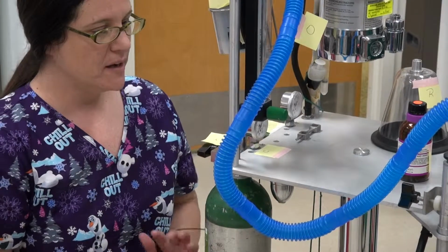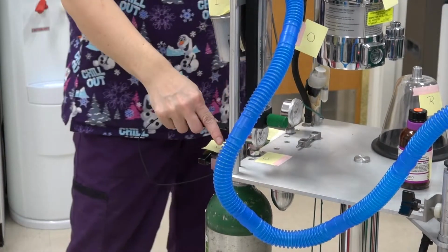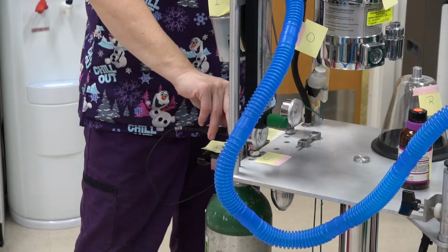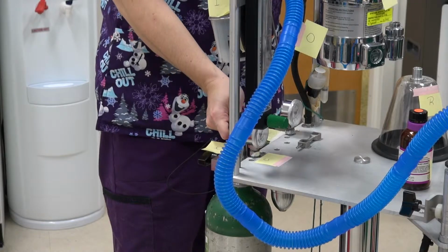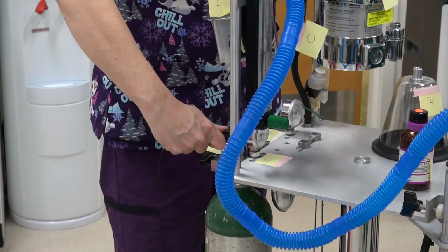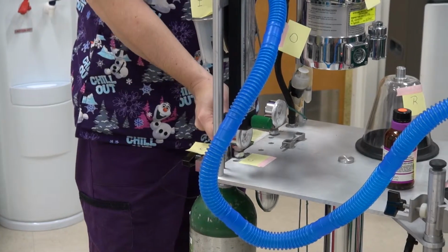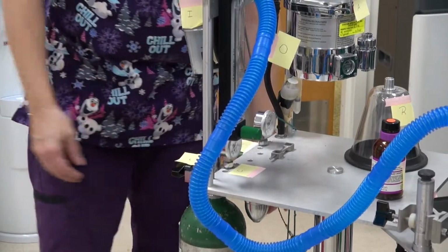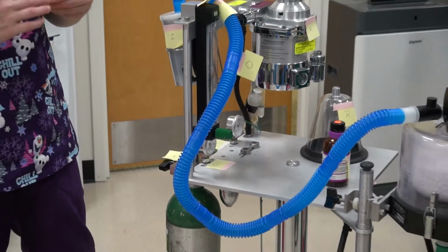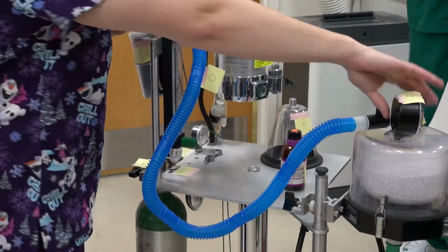If I want to check and make sure my tank is properly hooked up, I'm going to turn my oxygen on, correct? And the same thing, it's going to be righty tighty, lefty loosey. Obviously, in this machine, we have a leak, but that's what it will do. Okay? So that way you can turn your oxygen on and off. Okay, so we are at L. What is our L?